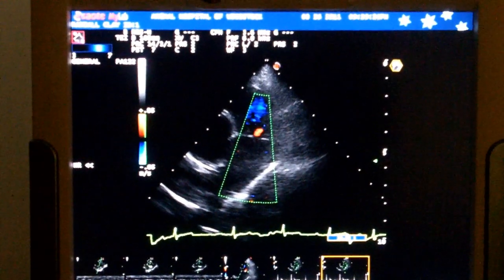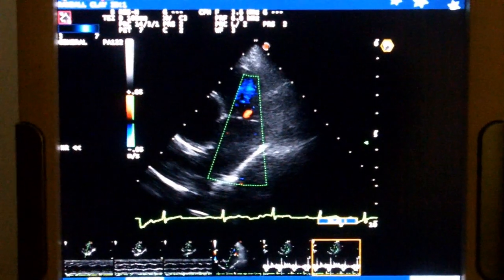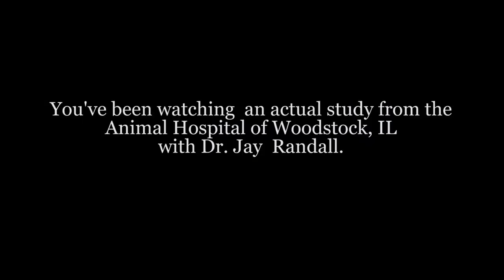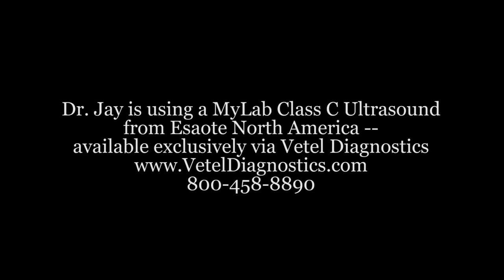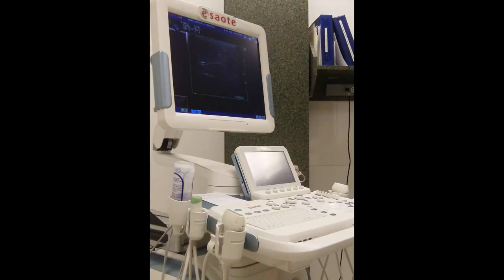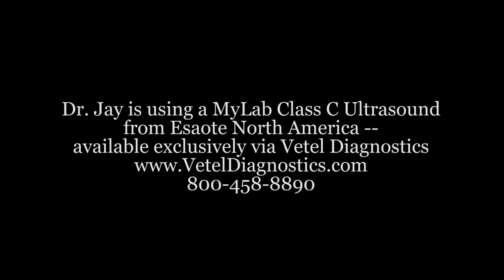You've been watching an actual study from the Animal Hospital of Woodstock, Illinois, with Dr. Jay Randall. On a typical day, Dr. Jay performs four to six ultrasound studies before noon. It allows him to give a better diagnosis while keeping his patients in-house for treatment. Dr. Jay is using a MyLab Class C ultrasound from Esaote North America, sold exclusively by Vetel Diagnostics.